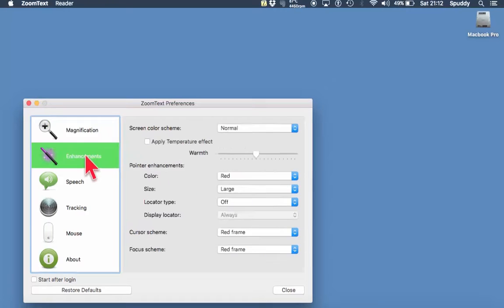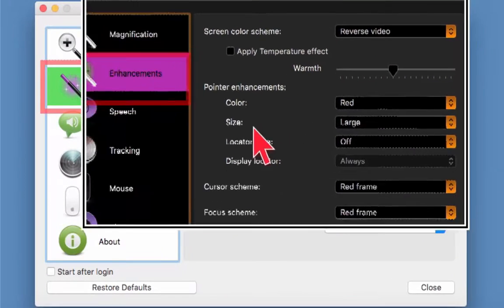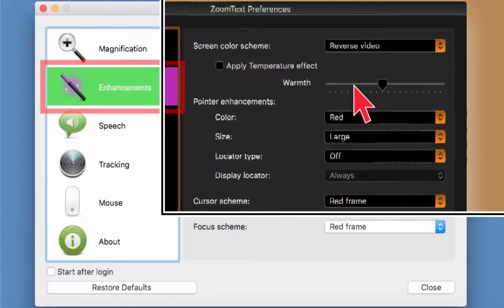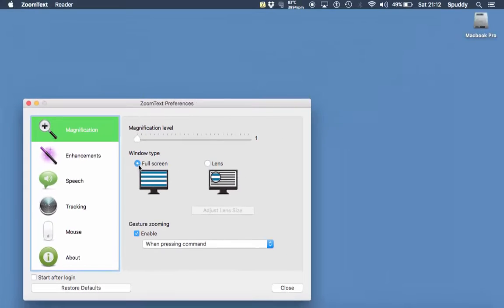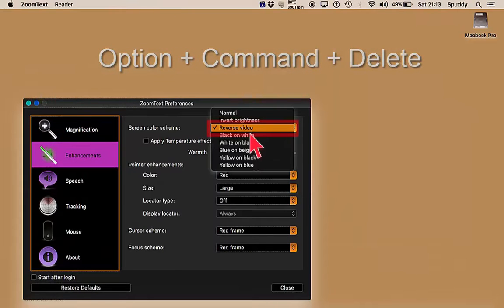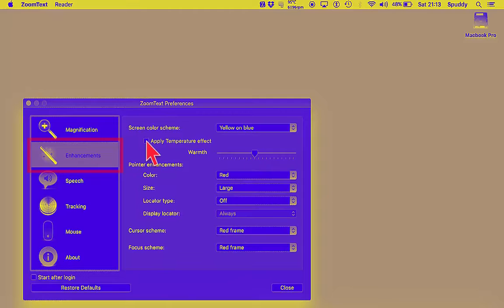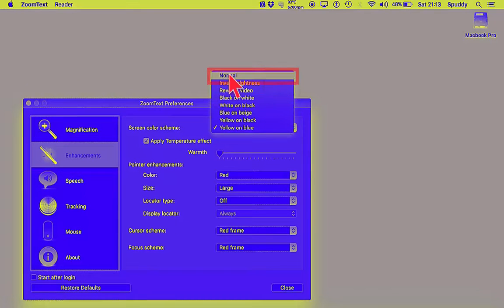So that's magnification. Let's go to Enhancements. Under colour scheme I'm currently on Normal — let's put that on Reverse Video. Because I'm in lens mode it only applies within the lens, which is really handy. If you want the whole screen to use that, turn it off, go to magnification, change it to full screen, go back to Enhancements, turn it back on. Then you can choose options like white on black, or yellow on blue, which stands out quite well. You can also apply a temperature effect and add warmth. I'll put it back to Normal.